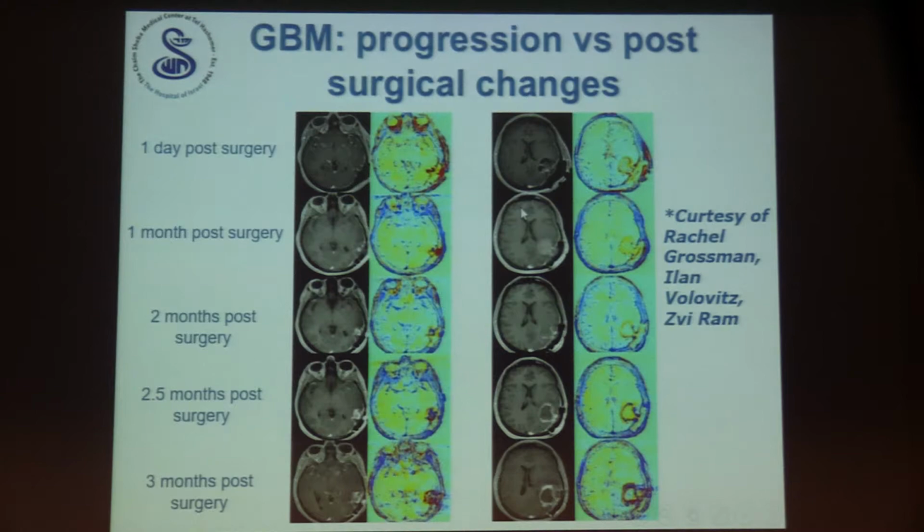But we had a few studies where we scanned patients early on. This is an immunotherapy study done with a group at Ichilov, and there we have some very early post-surgery images, so I just wanted to share them with you. This is a patient that was scanned 1 day post-surgery. These are 2 slices in the same lesion, and then as a function of time thereafter. So in this case, you can see that there was kind of residual tumor that maybe you can see all the way from the beginning, and it grew with time to be tumor.